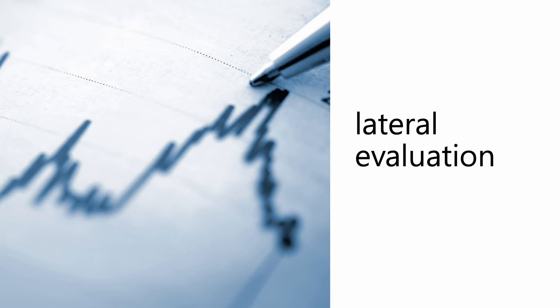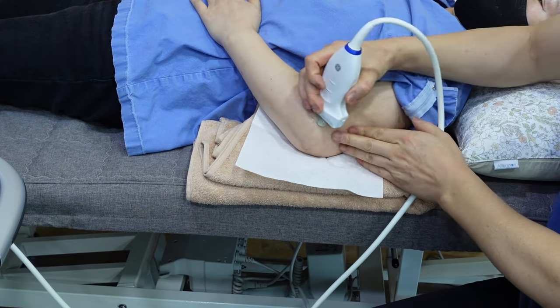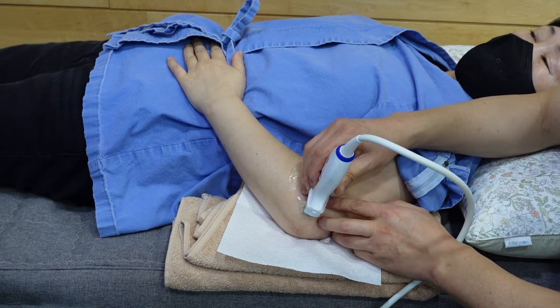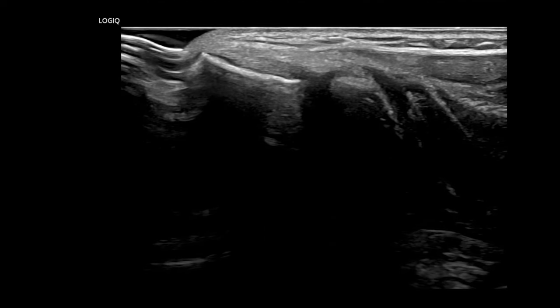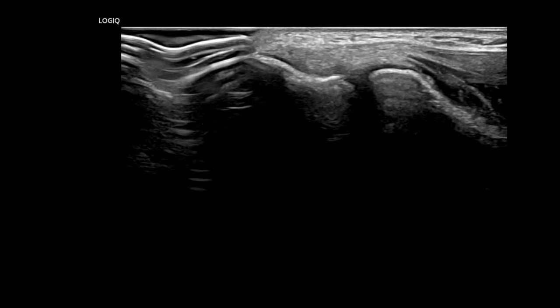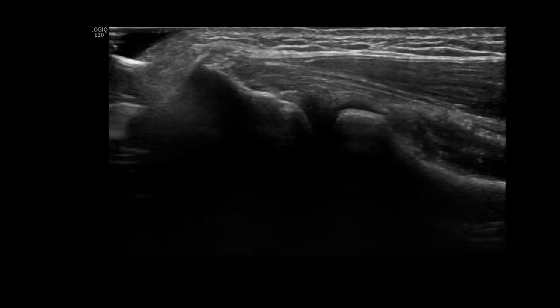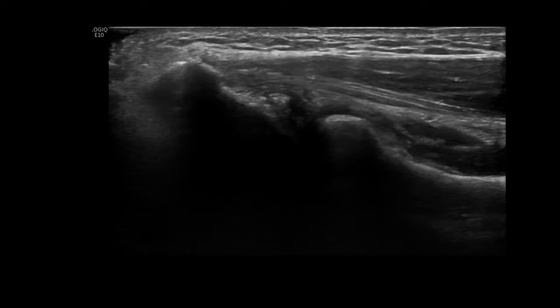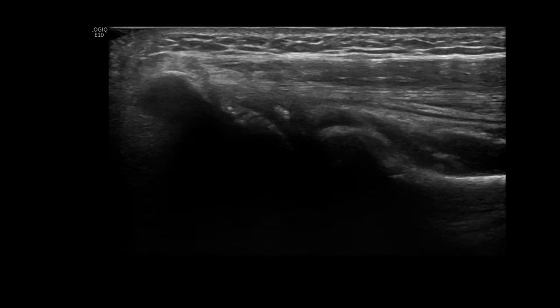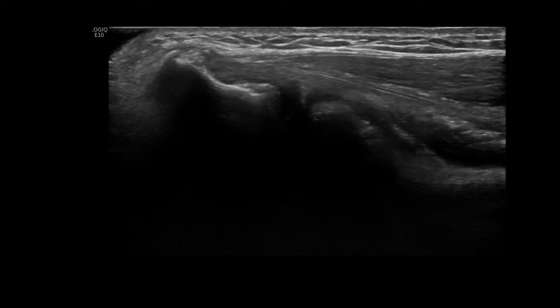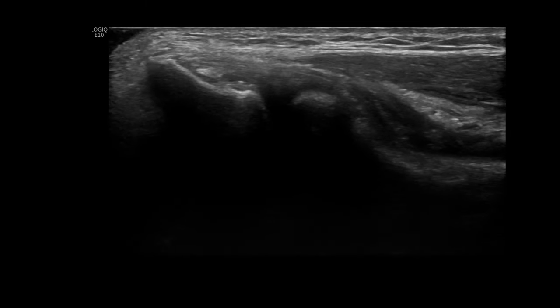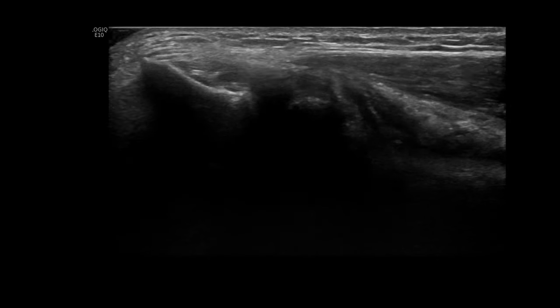For lateral evaluation, the lateral aspect of the elbow is examined with the elbow flexed and the forearm pronated. After evaluating the common extensor tendon on its long axis, coronal planes are utilized by positioning the cranial edge of the probe on the lateral epicondyle. The attachment of the common extensor tendon typically presents a uniform, hyperechoic, triangular shape. It is important to assess the lateral epicondyle for any surface irregularities or signs of enthesopathy. Under normal conditions, the lateral collateral ligament complex cannot be distinguished from the overlying deep portion of the extensor tendon due to their similar fibrillar echo texture, and can only be estimated by the location of the structure.